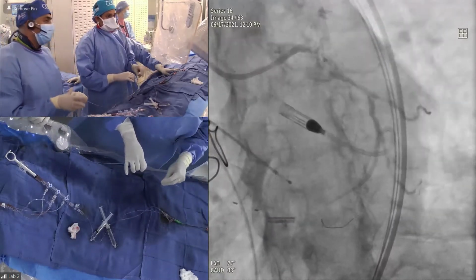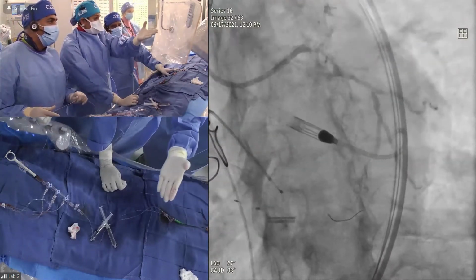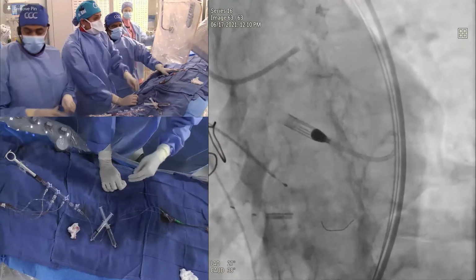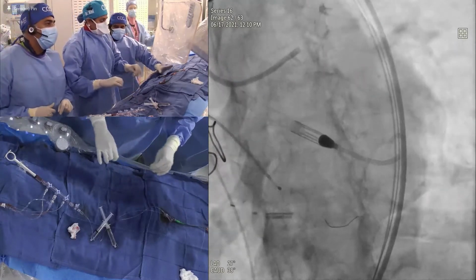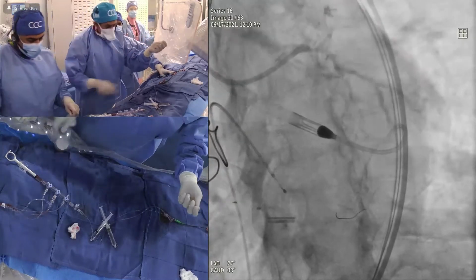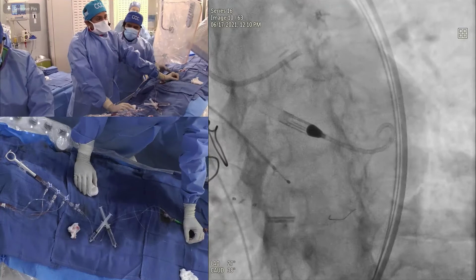Tortuosity, to me, I think. It's already 1.5. See that? The vessel is opened up, cut. Okay. There's a clear gutter, I think. We will just balloon. The question is, burr-wise, you're done with 1.25. Do you upgrade it, or do you try to see if your balloon can open up the lesion, then you don't need to upgrade it? I think that's reasonable.